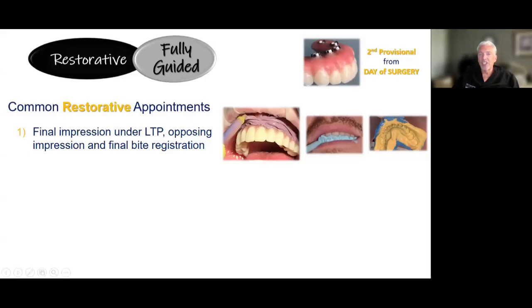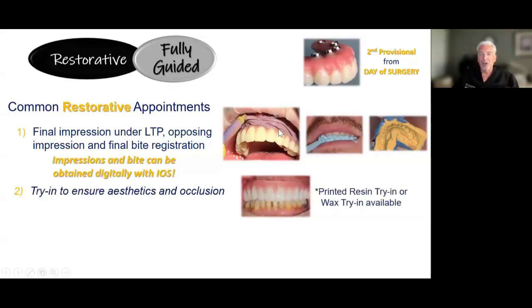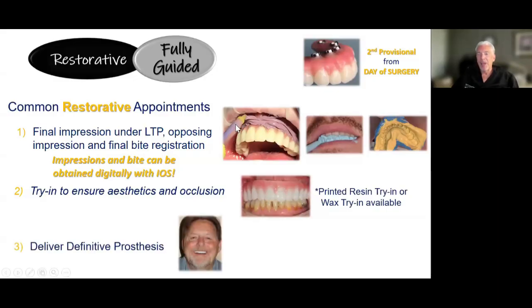So yes, we're showing my analog, but you don't need to do any of this. You can do all digital with this as well. So you don't have to do a physical impression. This could be a digital impression. You just scan the bridge in place, scan that gap.